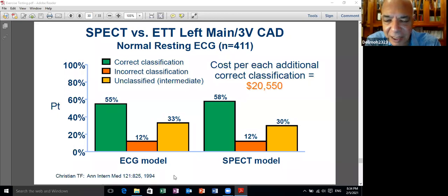احنا ما حدش يطلع بعد المحاضره دي يقول ان احنا لغينا الاكسرسايز اي سي جي، لكن ورينا عده نقط مهمه. نمره واحد انه ده probability تيست، بتحول من هاي probability الى لو probability، او ما هواش diagnostic of anything. نمره اثنين ان السنسيتيفيتي بتاعته inflated اكتر من الحقيقه، والسبيسيفيتي بتاعته deflated اكتر من الحقيقه، فهو needs to be corrected.